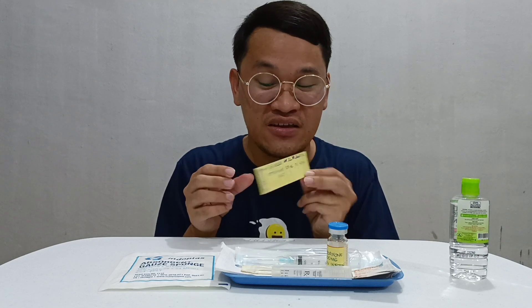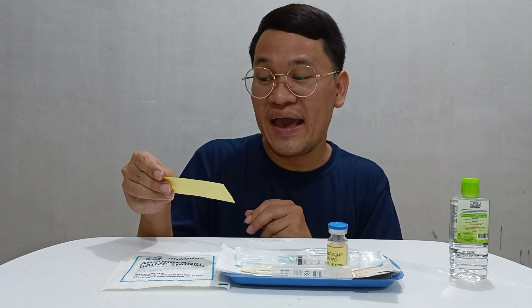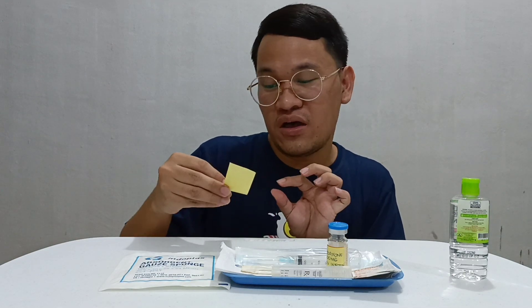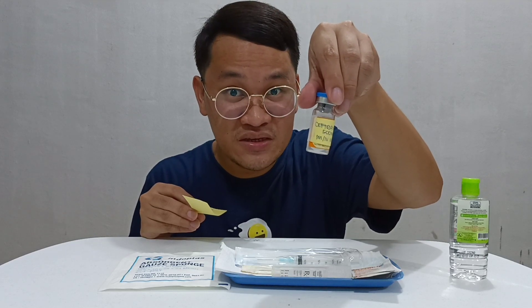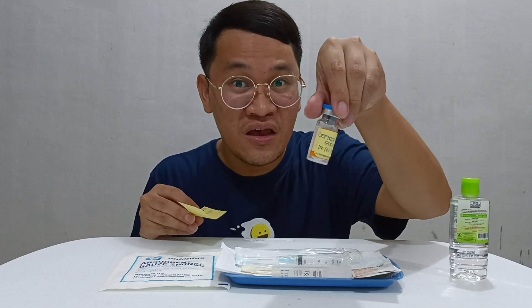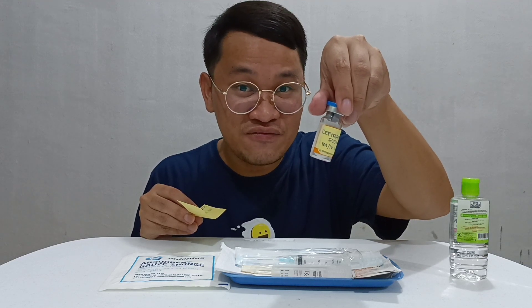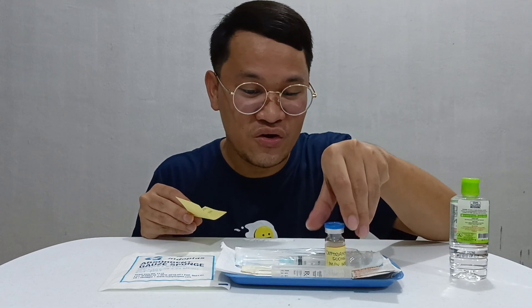I have here the medicine ticket as our basis. I just transcribed it from the physician's order. It's written here: ceftriaxone, 500 mg. I am now after negative skin test. The ceftriaxone is right here — this is my antibiotic to be skin tested. Later, if there's no reaction or there's a negative skin test, then I can give it to my patient intramuscularly as ordered.